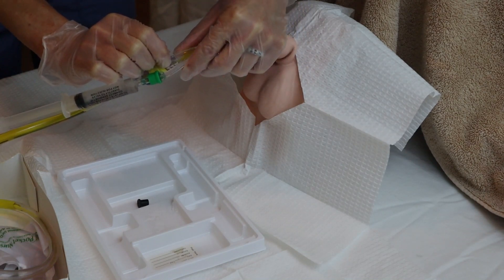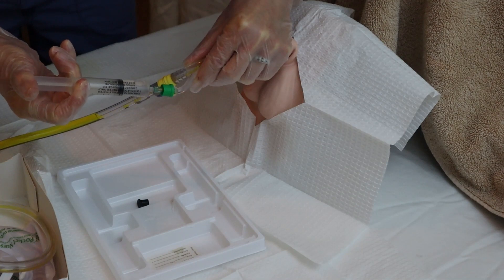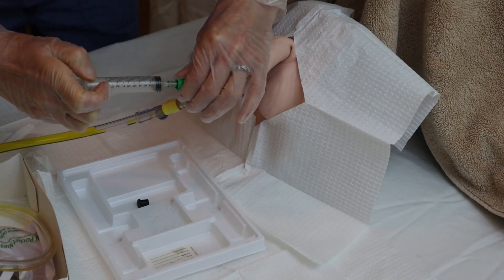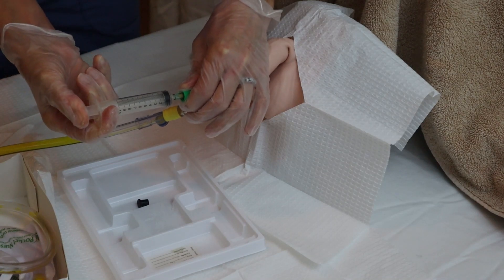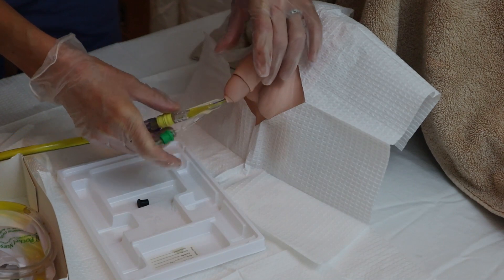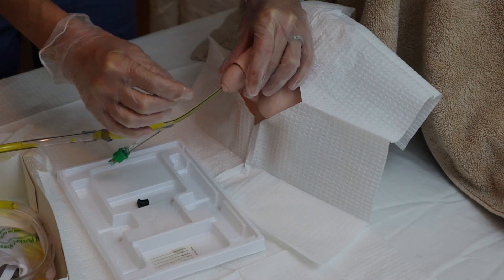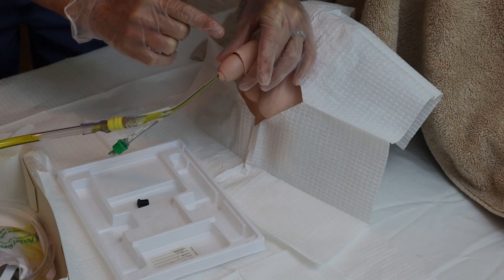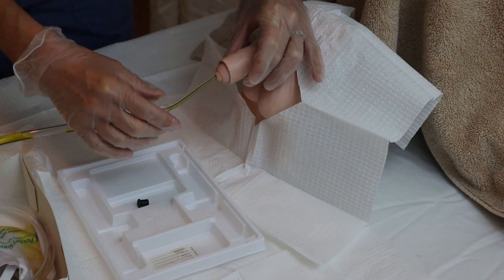Once you see urine flowing, continue inserting, and in the male patient it's perfectly fine to go all the way to the bifurcation — the Y piece at the end of the catheter. At this point my sterile procedure is complete. I can let go of my left hand, stabilize the catheter so it doesn't slide out, and inflate the balloon. Make sure to inflate the entire syringe or whatever is recommended by the manufacturer. Hold the port to disconnect the syringe, otherwise the balloon will automatically start to deflate. Hold the plunger once it's completely inserted, then remove it. Gently pull the catheter back until you feel resistance, which means the balloon is now seated at the bladder neck.